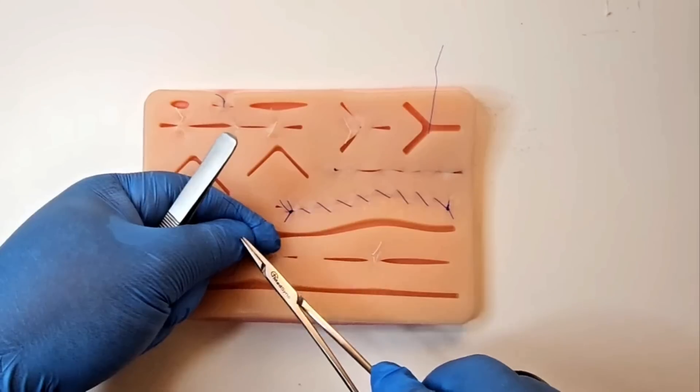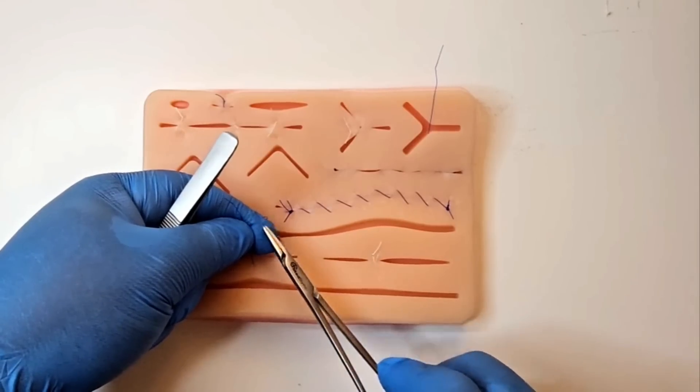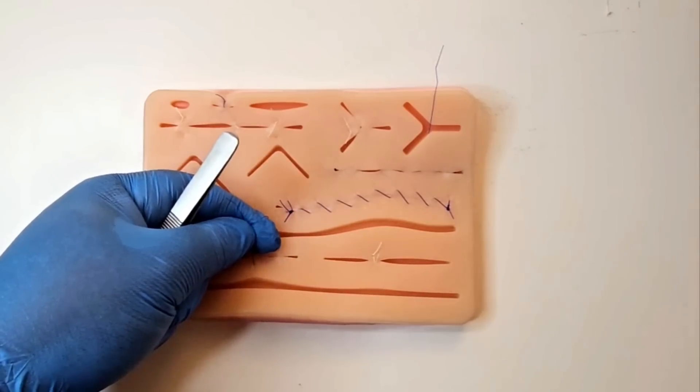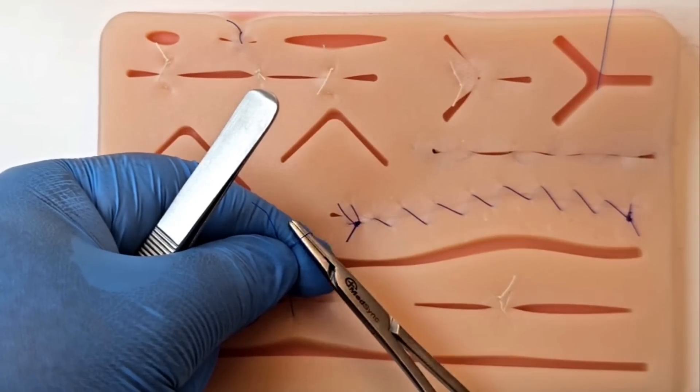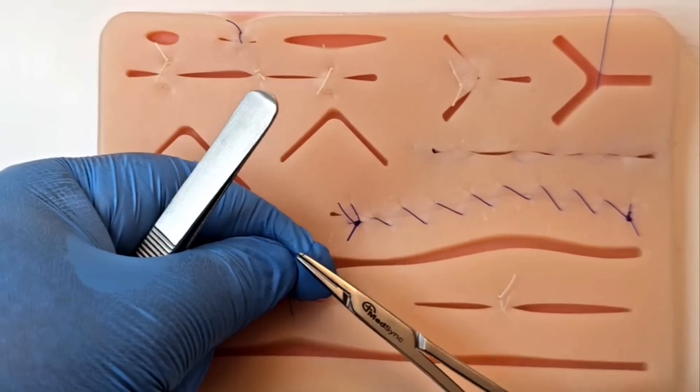Keep the tension between your thumb and index. Your needle holder now goes under the suture and you grab the short thread and pull it through.